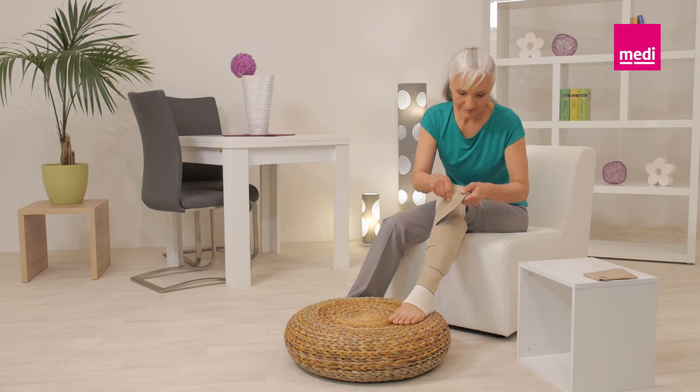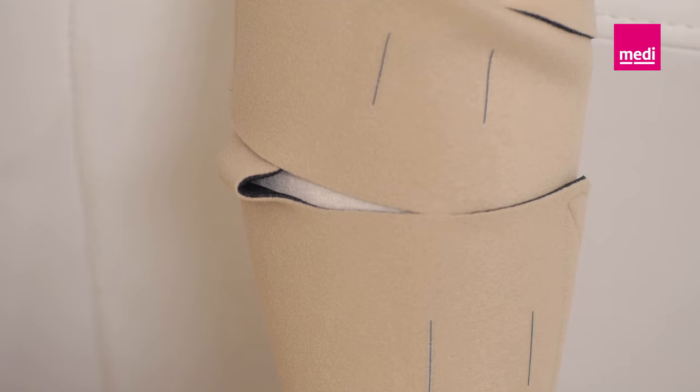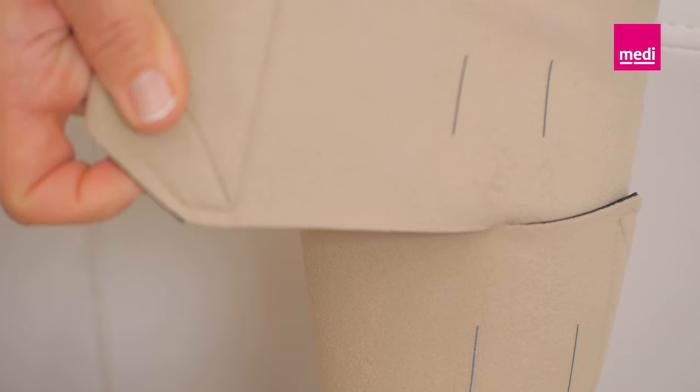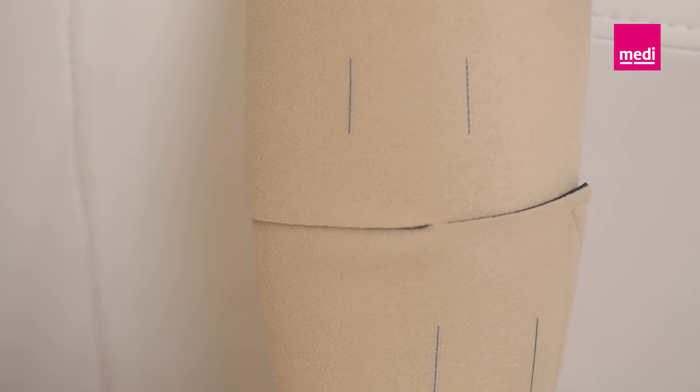Adjust each band to a firm and comfortable compression level. Ensure that the bands are placed in an alternating order. Once all bands are secured, inspect the garment for any gaps or creases. Adjust the bands as necessary.